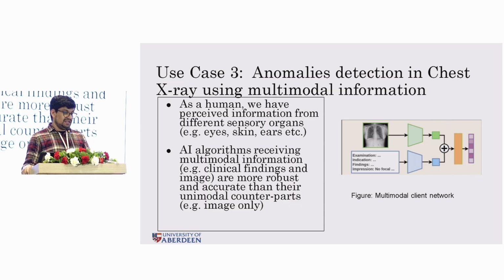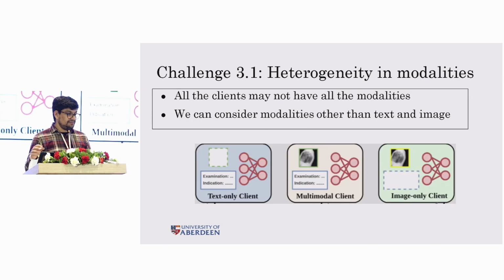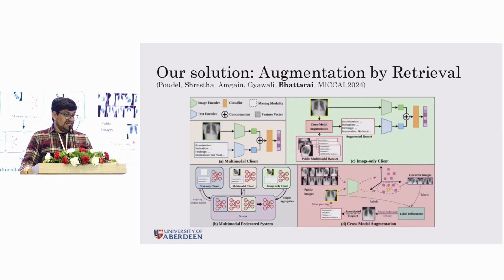The modalities we consider here are X-ray, the radiology scan, and the clinical findings, okay? These are the different combinations that can be present; if we consider three modalities, then 2 to the power 3, and so on. So different combinations can exist, right? This is our solution, which we presented this year at MICCAI, a top conference in medical imaging.